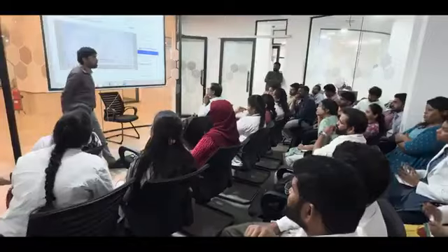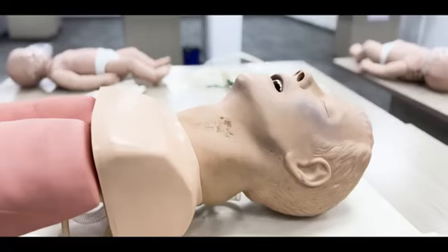So every clinical scenario is being addressed here, and we have got the necessary instructors and the trainers for that. This is going to assume a very important dimension in the simulated art of learning skills in the undergraduation and in the post-graduation of the medical school.